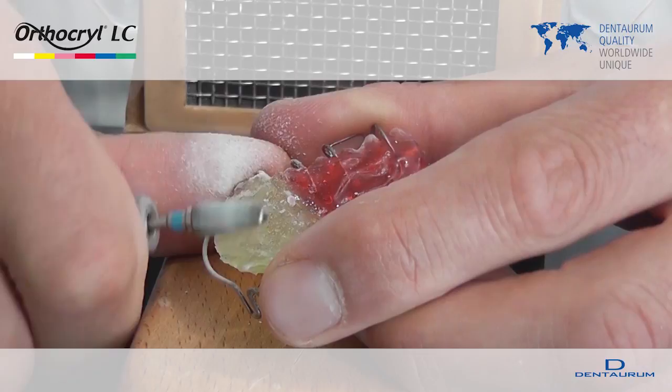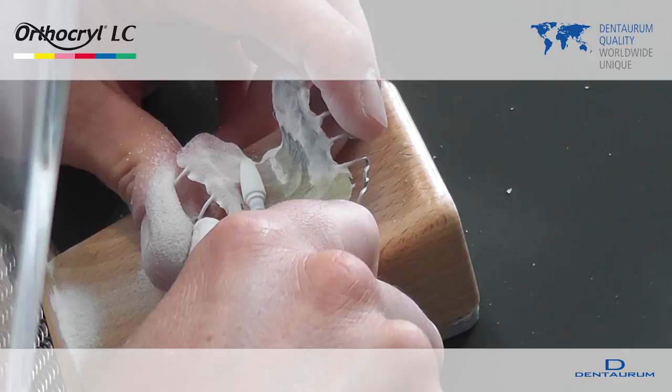Cross cut hard metal burrs should, however, not be used. Hard metal burrs with transversal toothing or burrs for soft acrylics are better suited.